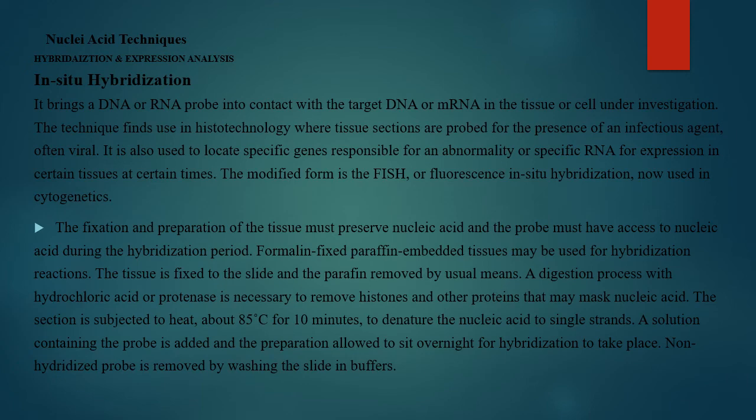The section is subjected to heat, about 85 degrees Celsius for 10 minutes, so that it denatures. A solution containing the probe is added and the preparation is allowed to sit overnight for hybridization to take place. Non-hybridized probe is removed by washing with the buffer.